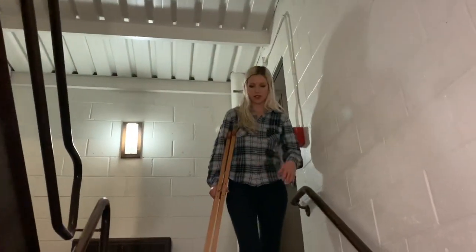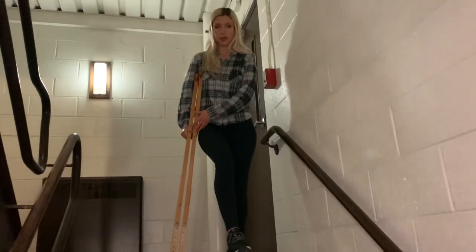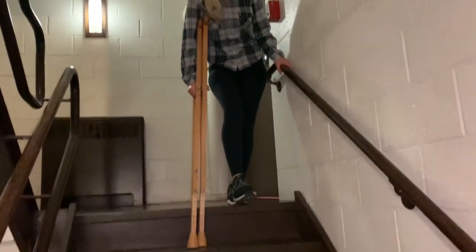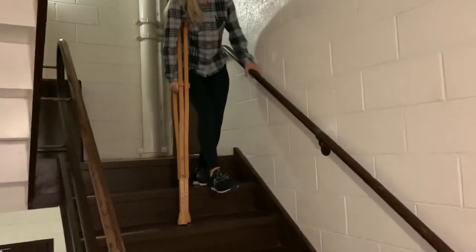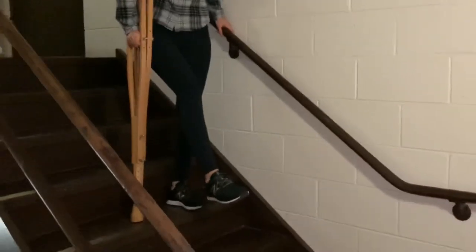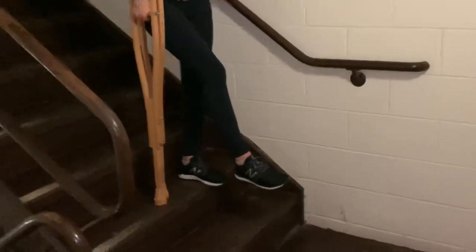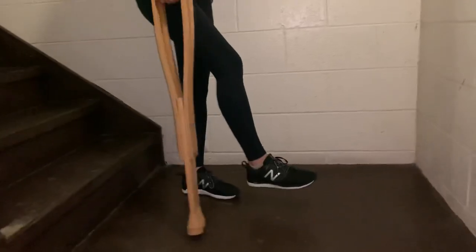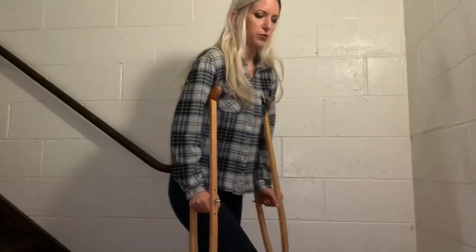Okay, and then when you're coming back down, you're going to bring your injured leg ahead of you, and that is going to go down first along with the crutch, and then you're going to bring your good leg down afterwards. So crutch down, foot ahead, support your weight in the rail and the crutch, and bring down your good foot. Back around to the other arm and proceed as you would if you were just walking.